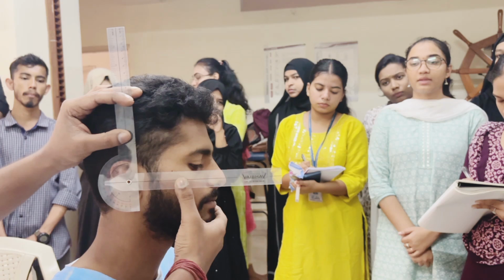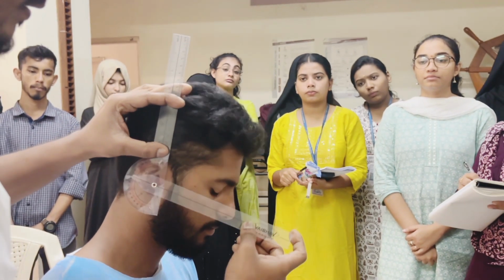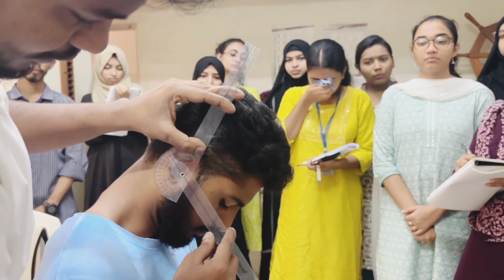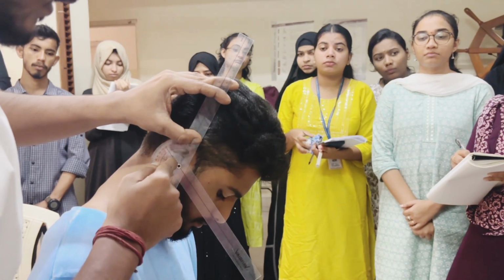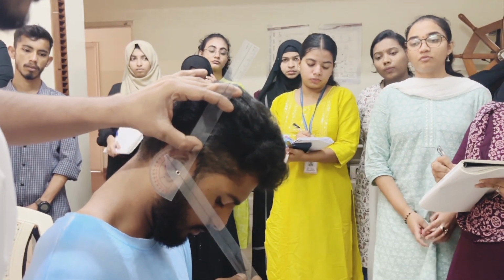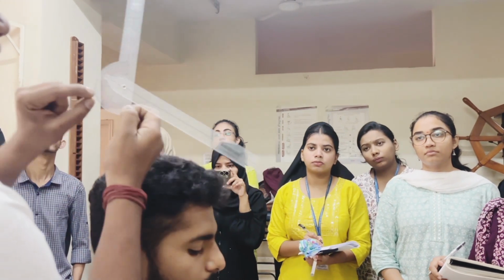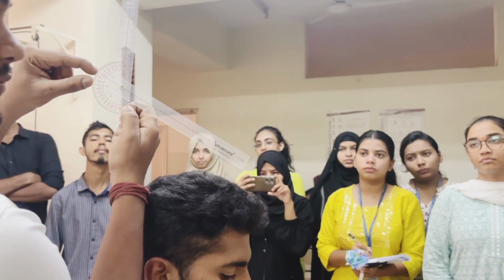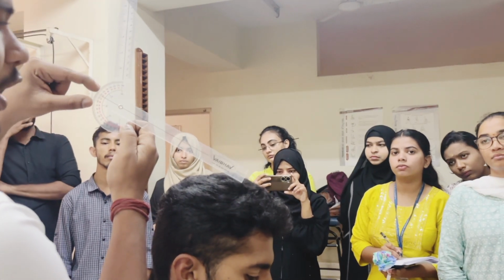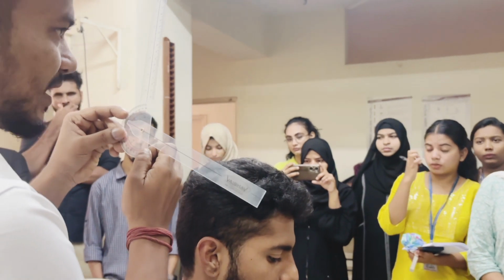Now we will ask the patient to do flexion. After the flexion movement, this movable arm should be in the same place, at the base of the nose. Then we will measure the ROM from 90 degrees. How much it comes, that is what we measure, because we first kept 90 degrees. That we will measure as cervical flexion.